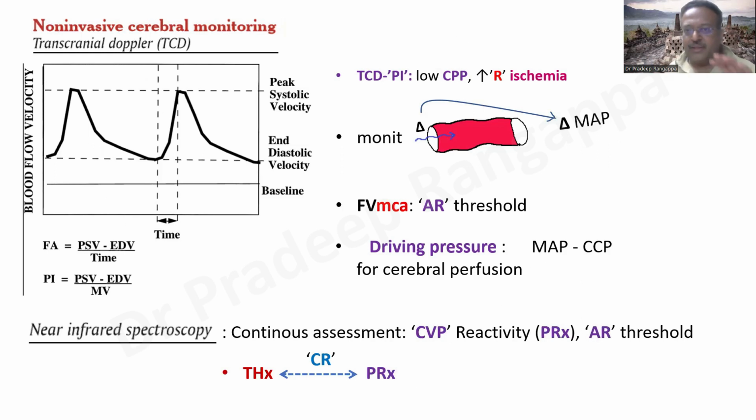So coming to my last conclusion slide. However much we talk about multimodal monitoring, the whole conclusion is that there is no one single tool. We can use all the information coming in from these devices as an adjunct to the clinical and the imaging correlation to guide us with regards to prognosticating and with regards to treatment goals.